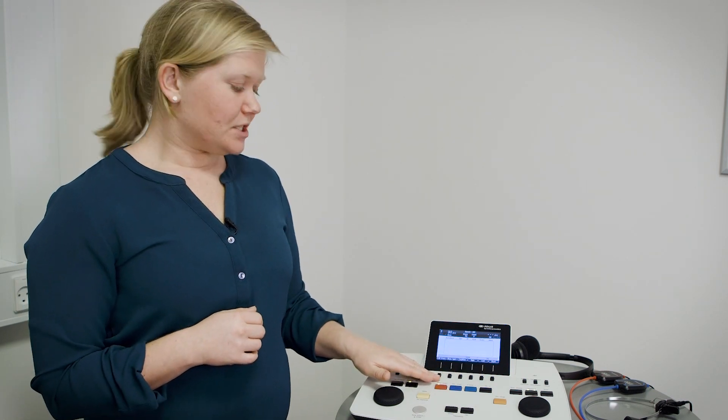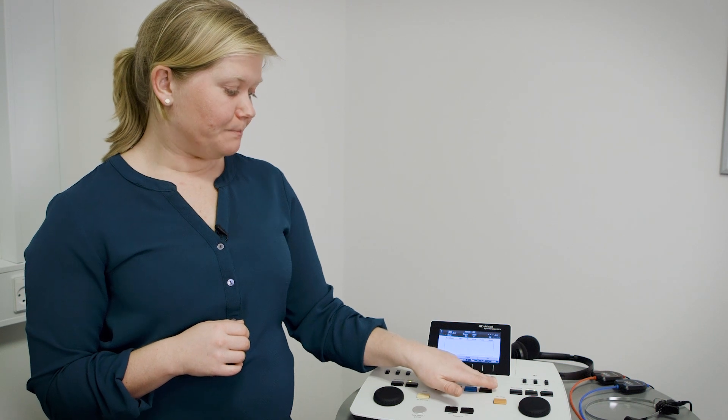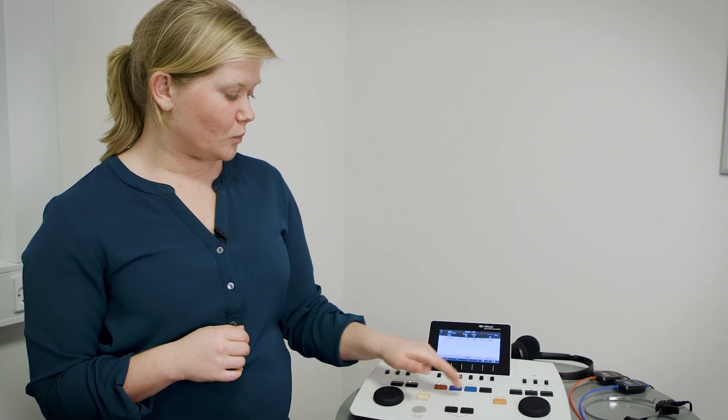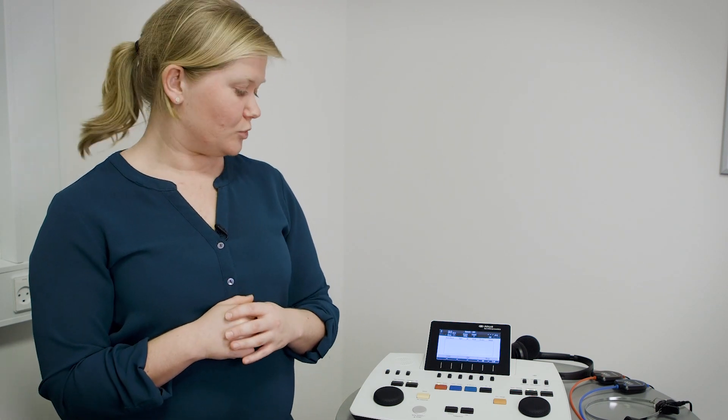Up here we have the five function keys where we have the start key, so we can press start which will take us into the running mode. So our speech test is now running and the patient will hear the sounds being present.